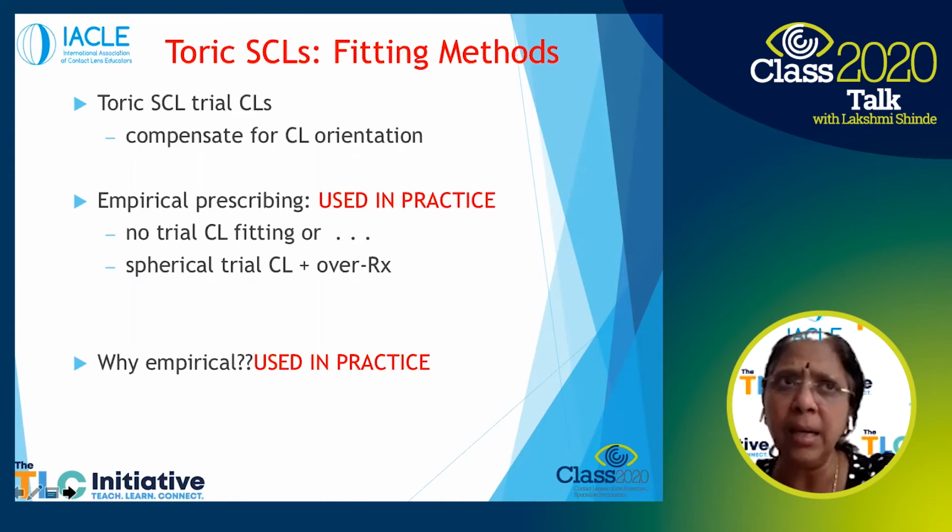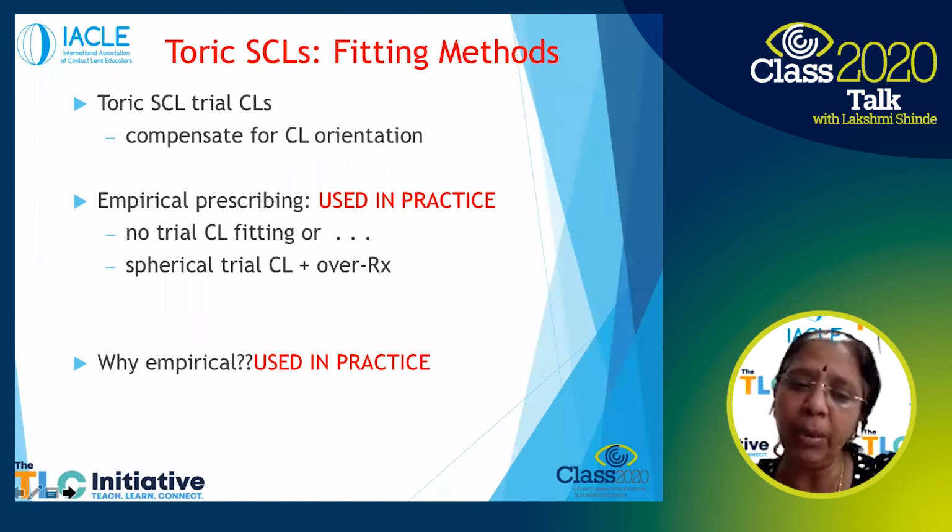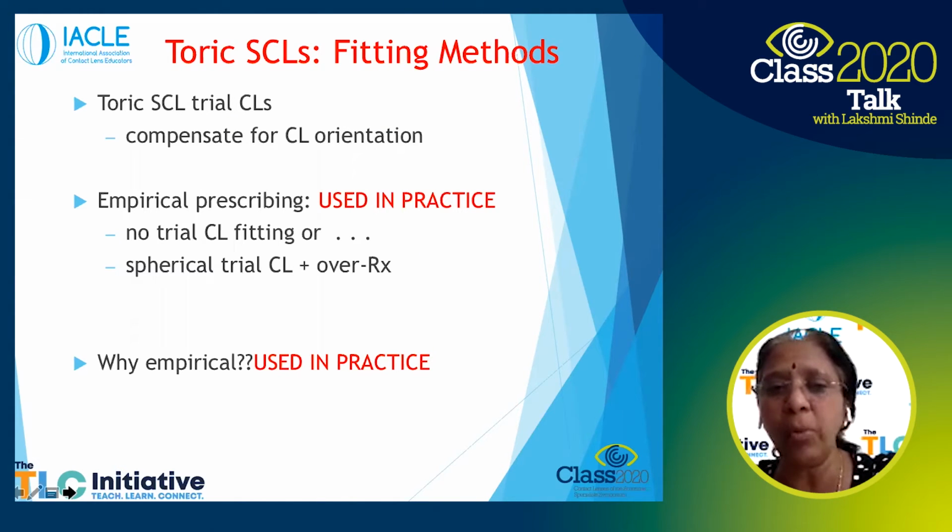And this is slightly different from what a student would look at. Maybe to a student, we always say, okay, let's do a trial. Let's see if it actually fits well. Then maybe we will dispense that. That's because they're students and they're learning. So that's the difference when you shift into a practice. You always look at quicker service and providing them with the optimal care.